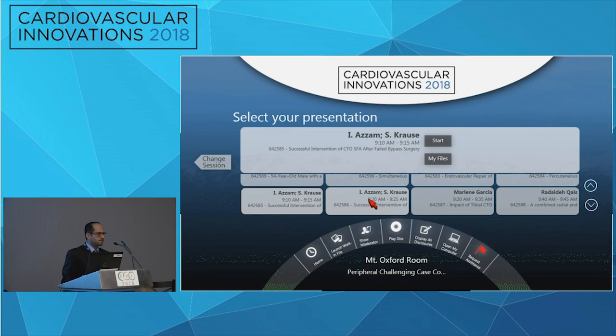So more of a comment, but a question. Before you started, this must have been a whole day affair, right? And how did you talk to the patient, and then when you were there, how did you make these decisions? At any time did you say, okay, I've got to stop and come back, or was this multiple staged procedures, or just one? And the last thing is, did you ever think about getting into the graft? With the use of the Outback and this and that, sometimes you can come up, but to me, once you get in the pelvis, the risks go up, right?